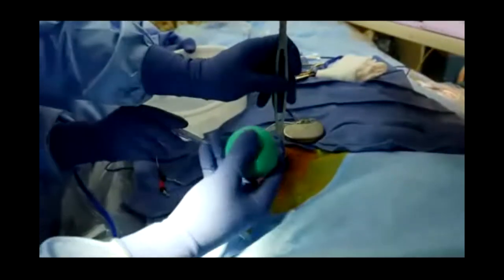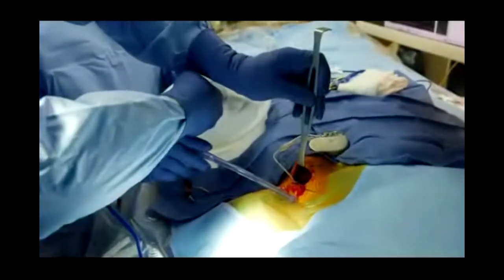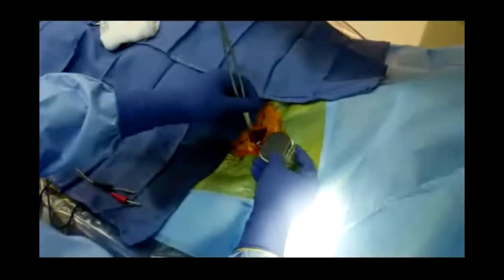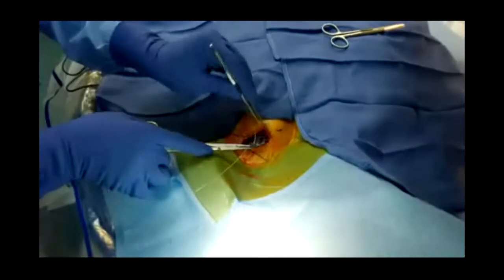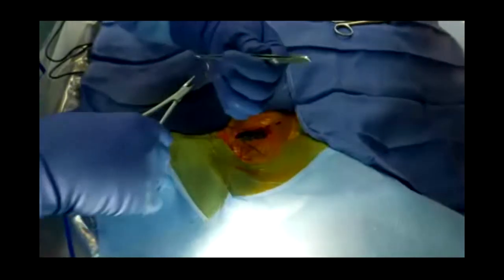Now we're flushing out that tissue pocket, removing any debris or dried blood that may have accumulated there during our procedure, and using this time to ensure complete hemostasis, making sure there's no bleeding from within the pocket, which could cause a complication later on. Having done that, we coil the device about the lead and fit it very snugly through that insertion site and into that pocket that we created. We want the device to go in the most efficient way possible to minimize the length of the incision that we needed, to minimize scar, to minimize the amount of suturing that we have to do, and again, to reduce the chance of infection or any bleeding complication.